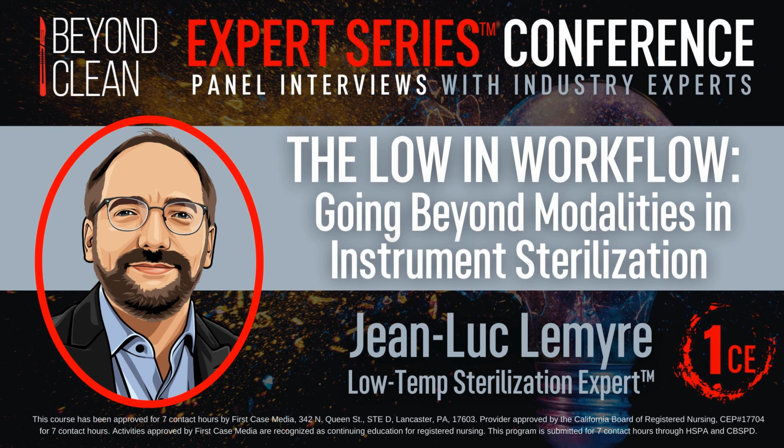It's not all that common to have administrative teams consult sterile processing when they're considering buying some new instrument system, and so we get the news that we've got this new instrument that's going to be used for a new procedure, and we look at the IFU, and according to the sterilization instructions in there, we don't have the equipment that we need to sterilize it.